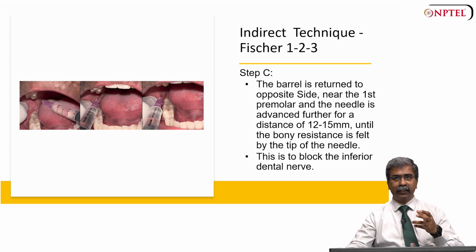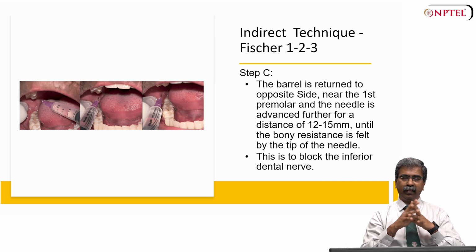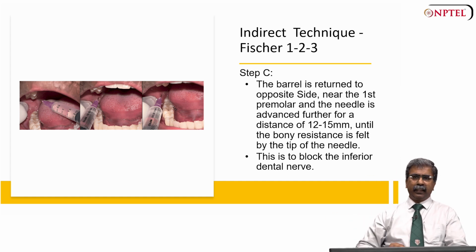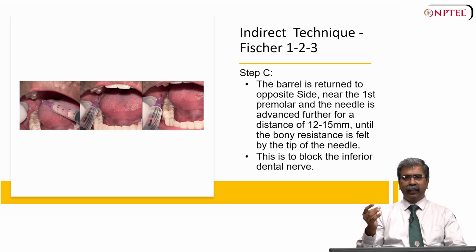And then, as usual, deposit 1.2 to 1.5 ml for the inferior alveolar nerve. Where do you check for anesthesia for the inferior alveolar nerve, lingual nerve, and for the long buccal nerve?